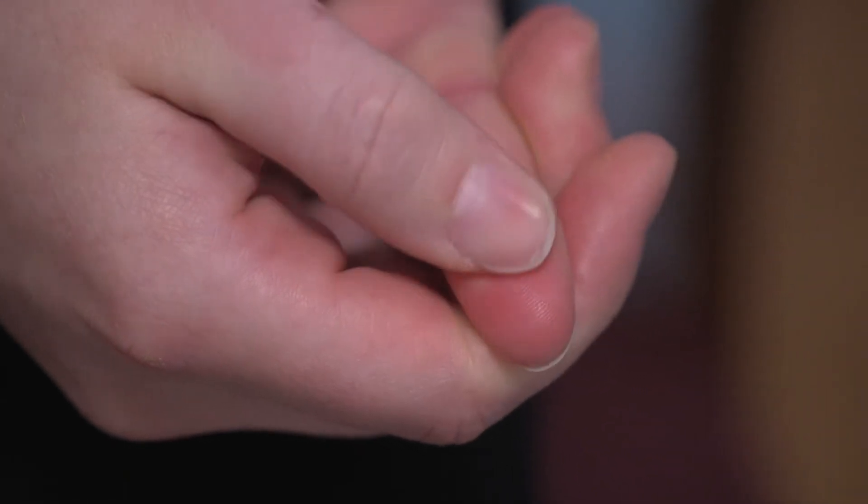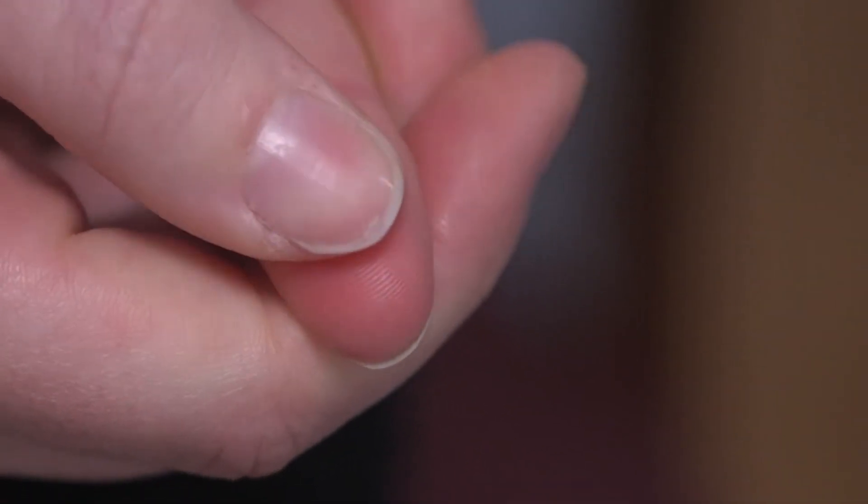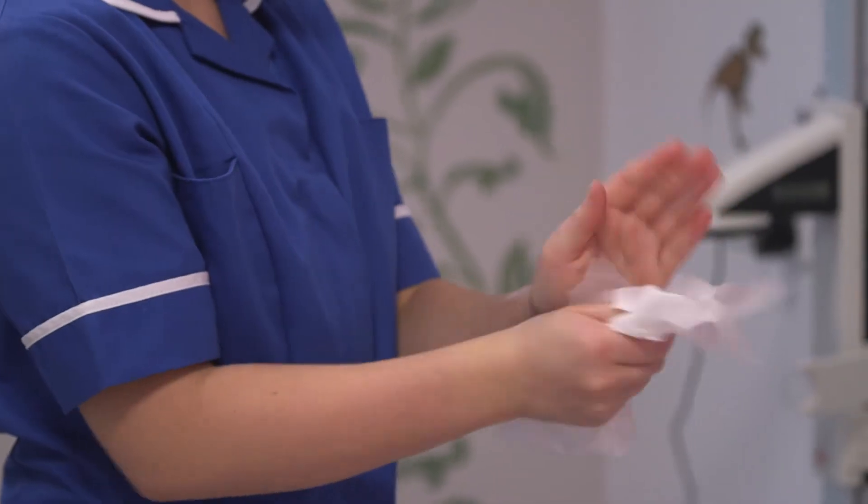Make sure your child's fingers are warm. This can be done by putting on some gloves or gently massaging the fingertip. However, do not apply anything hot as this may cause scalding. Once you have all of these things ready, you need to wash your hands.